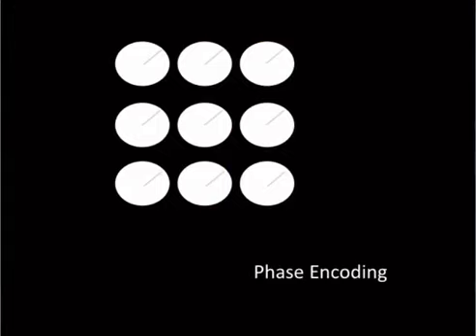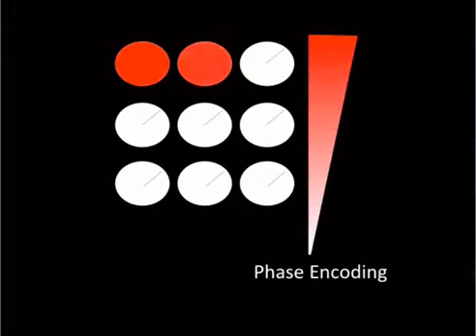Now, step two is this phase encoding direction. In other words, encoding spatial information in a vertical direction. In the second step of the process, a gradient is applied, causing the protons in the same row, perpendicular to the gradient, to have the same phase. All the protons at this point will have the same frequency, something like that. So phase encoding takes much longer than frequency encoding, and that's why it's typically done on a thinner portion.